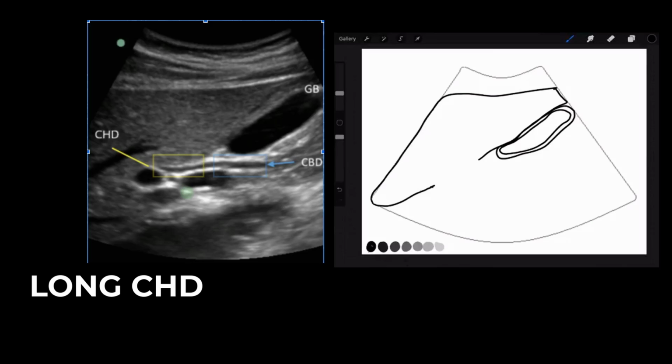And we can see a gap in the liver tissue, creating the porta hepatis. At the porta hepatis, we know that the portal triad transverses this area, with the portal vein showing segmentally here with thicker, brighter walls. We can also see then the duct coursing from inside the liver to outside of the liver, making the internal part the common hepatic duct and the external portion the common bile duct. You can see again bright white walls, and the third component, the hepatic artery at the porta hepatis.